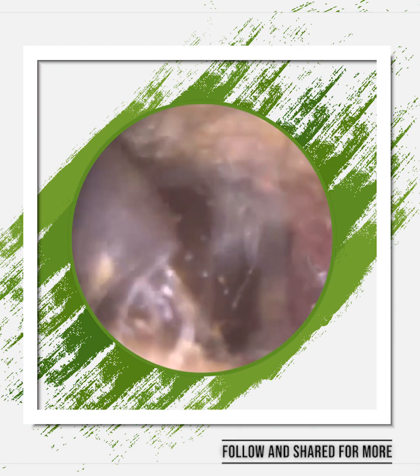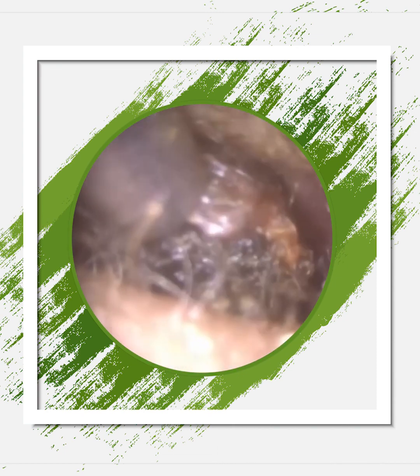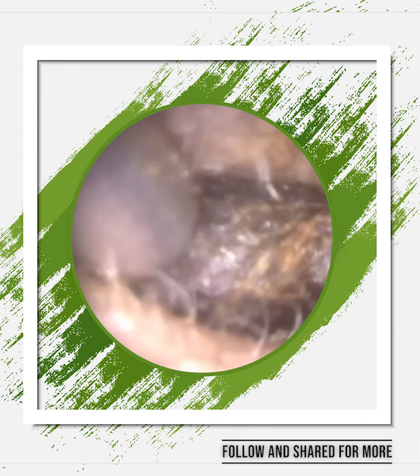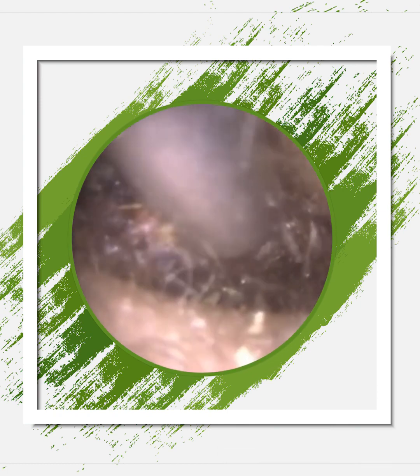I'm just trying to rotate this wax upwards, so I must roll it up and then roll it back down. Trying to squeeze it through, tease it through the second, well, sorry, not the second narrowing, the first narrowing. You can see I'm going to the top of the plug of wax and trying to bring it down and just trying to wriggle.